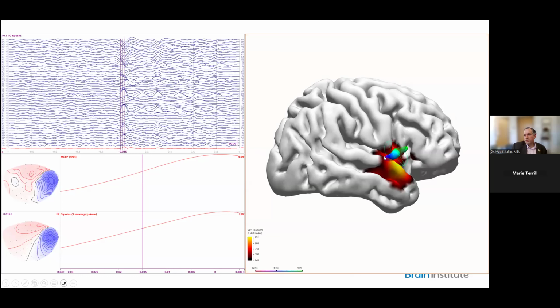So what if I did what we were talking about earlier? So here is the dipole at the mid phase of the rising of the spike. And it's oriented essentially pointing out towards us with a confidence ellipsoid that is only so big, about 2 gyri wide. Versus here is at the peak.